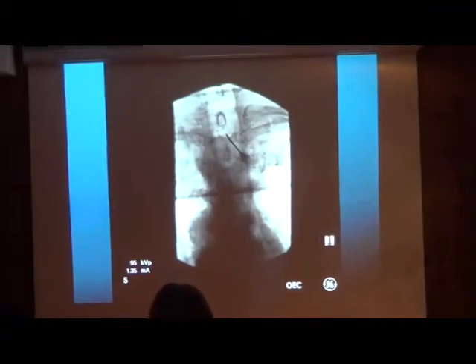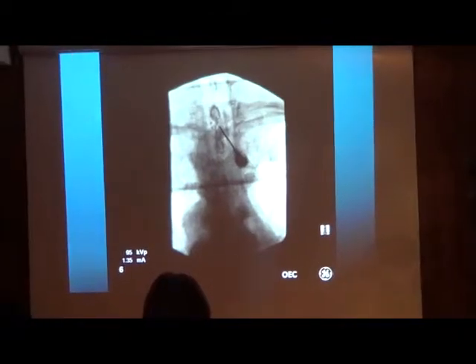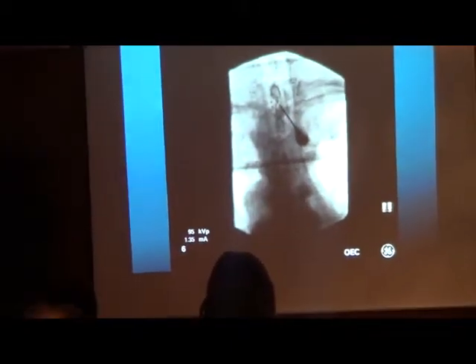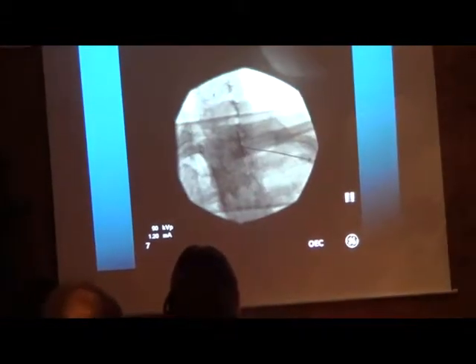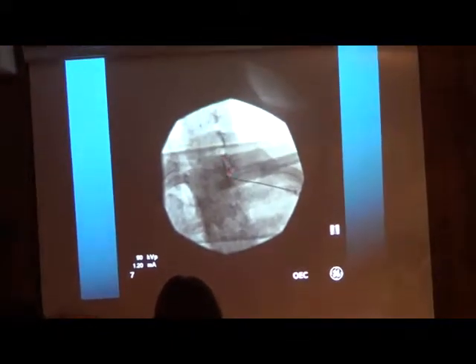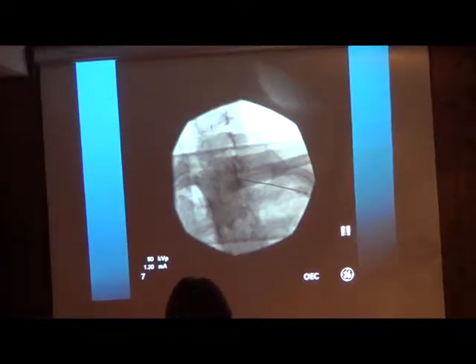You can see the needle goes to the epidural space, and then without confirming the needle depth, you inject the dye and see this patch spread. And when you see the patch spread, I'm more than sure it's possibly epidural spread. Here I confirm it. I use a contralateral oblique fluoroscopy, and I see epidural spread, and also patch spread at the site of the injection.